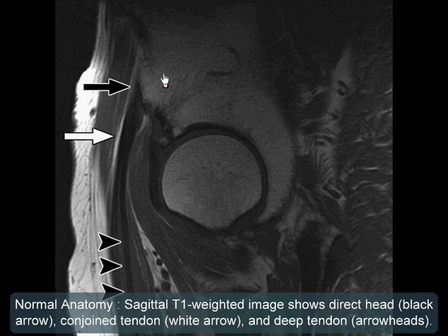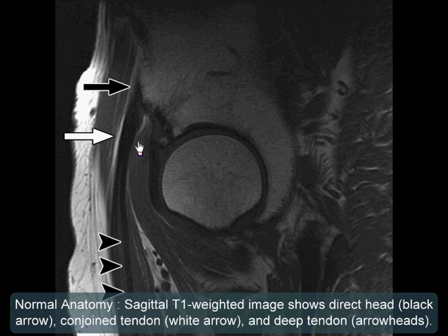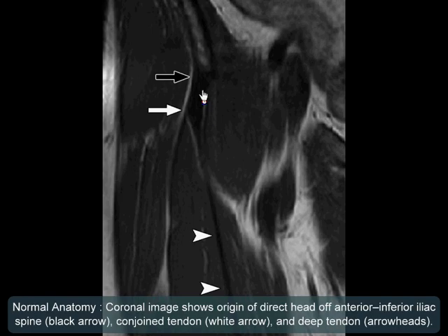This is the sagittal T1 weighted image showing the direct head, the conjoined tendon, and the deep tendon. A coronal image shows the origin of the direct head at the anterior inferior iliac spine, the conjoined tendon, and then the deep tendon.